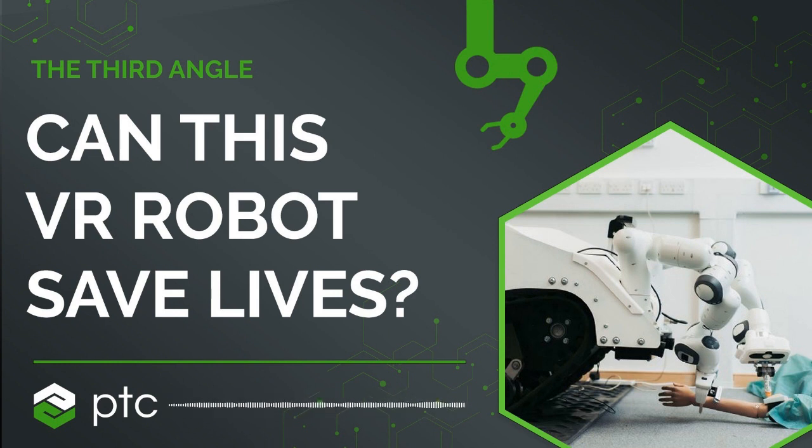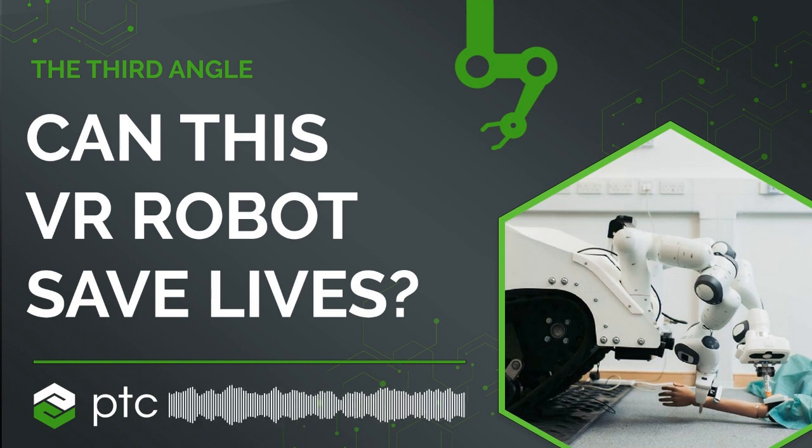I mean, this would be part of a larger system. In terms of practically implementing it, we suspect you would have a companion drone system. So this would arrive at a scene in a medical emergency of some description. The drone would go out and survey the area, identify casualties, and while the drone's doing that, this system is starting to travel to the casualties and then start to triage them. It's the first step of what we think is a much larger system.